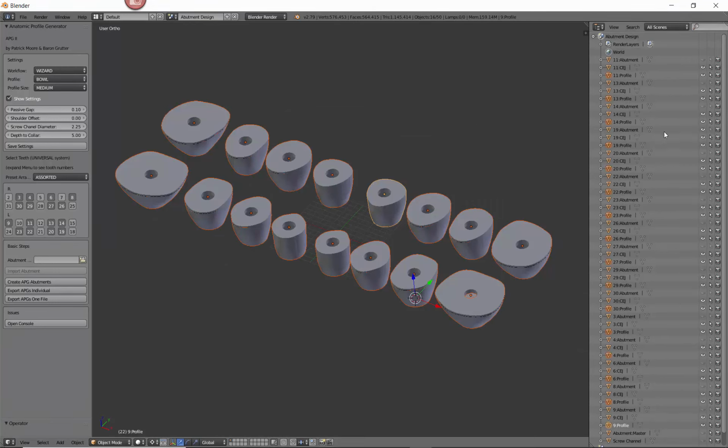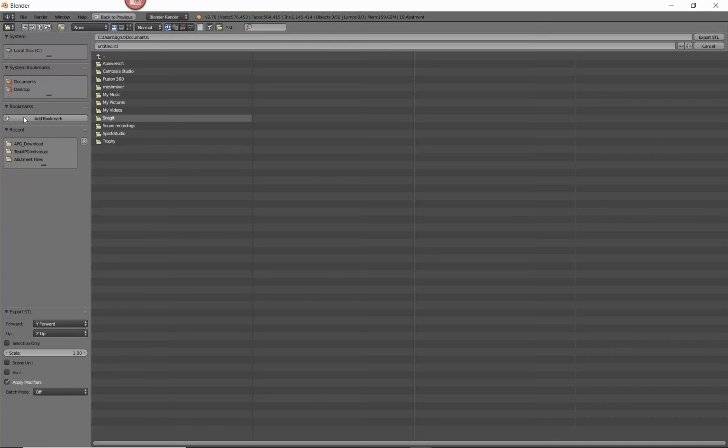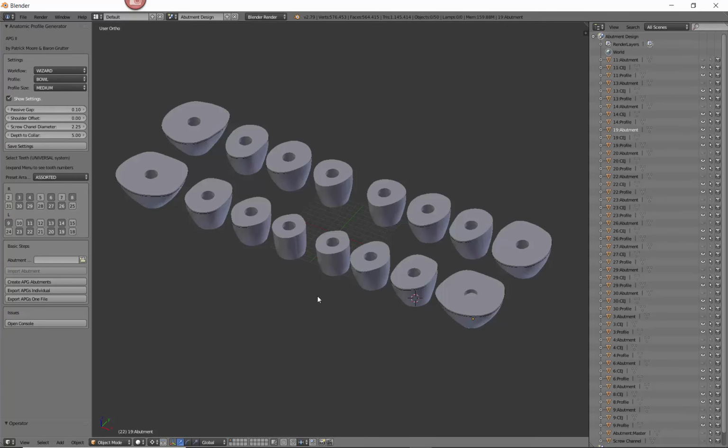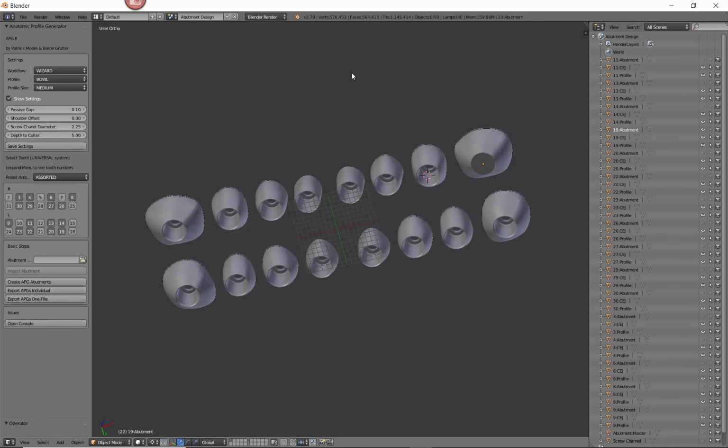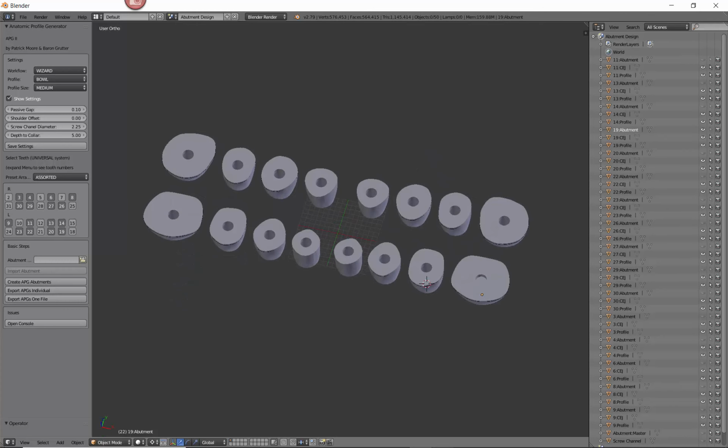Just click on the abutment, select it, and then I'm going to come to Export, STL, and then just figure out where you want to export it. Hit Export STL. So that's just a way to save that in case you want to use it later, without having to re-input the numbers. But really, I would just keep those numbers around just in case you somehow lose that STL or whatever. You've got your measurements all taken care of. So again, just get your measurements, plug them in there, and away you go.